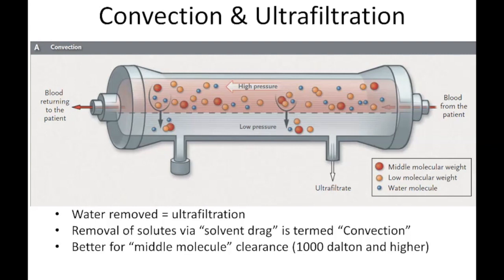And that filtrate of water and plasma that comes across these pores basically becomes your so-called ultrafiltrate. Another word for that would be effluent, but it's basically just plasma water. So nothing different than you would get if you popped a blister and had fluid coming out of that clear colored fluid. The electrolyte concentrations will be exactly the same in the ultrafiltrate because it is just a filtrate of the blood water down there as well.